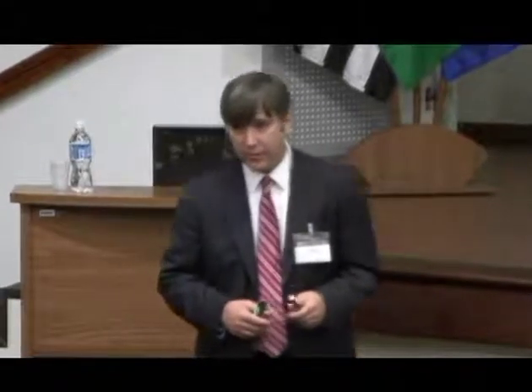I'm only showing the spectra from particular excitations that we've found to be most diagnostically useful and that are easy to show what they mean. We collect many different spectra that are a little more difficult to interpret. That particular one, I'm showing the blue-green fluorescence emission at about 380 nanometer excitation, so it's pretty easy for that one to kind of see what's happening in terms of the absolute intensity.